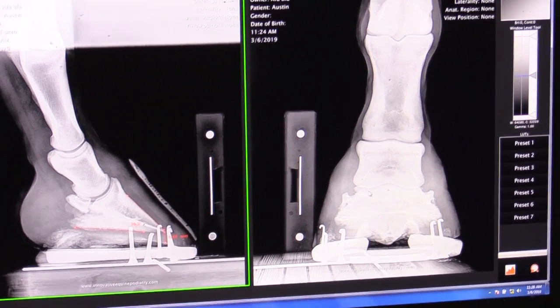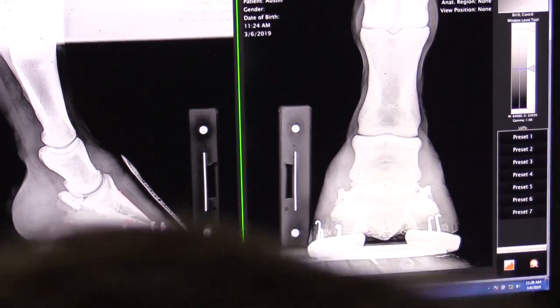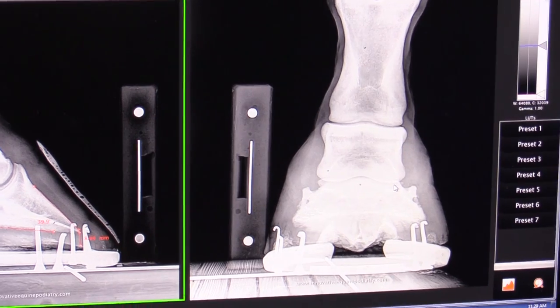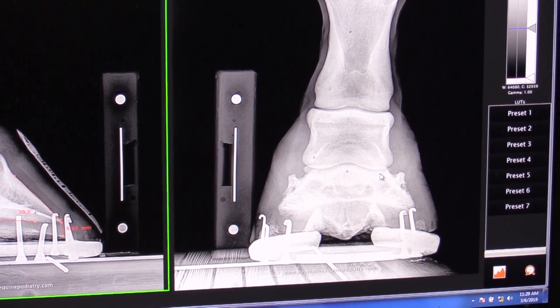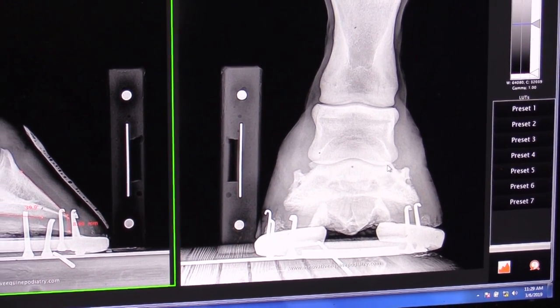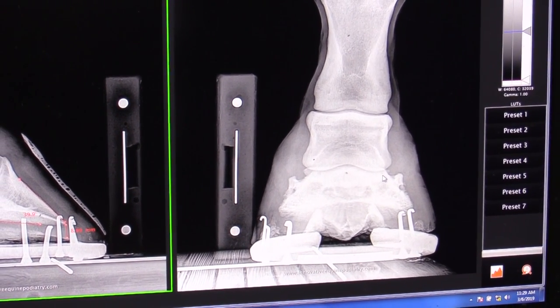If we look here on his right front, so we look at the medial side, can you guys see my arrow on the x-ray? That good? Is it kind of wobbly? Everybody getting seasick? So if we look at our joint spacing here, our medial side is compressed, and even though the coffin bone is actually lower on the medial side, I'm probably going to work to try to drop him to the medial side to try to level that coffin joint.